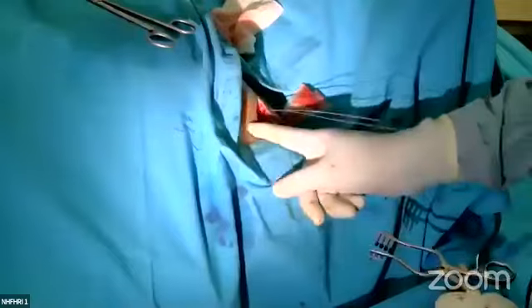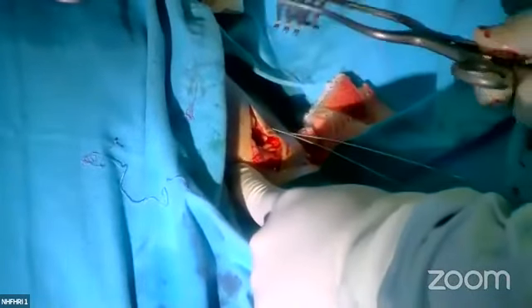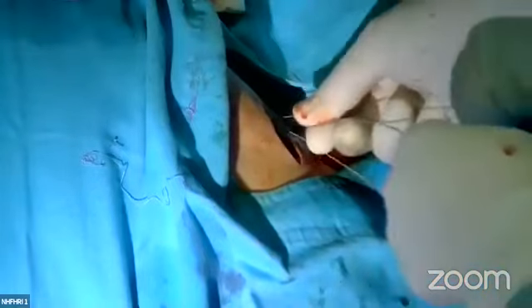Zoom, make it zoom, please. So the pocket is just below my puncture site. Many operators do the pocket and incision first, then the puncture. But I usually puncture first, then make the pocket and redirect the short wire into the pocket.